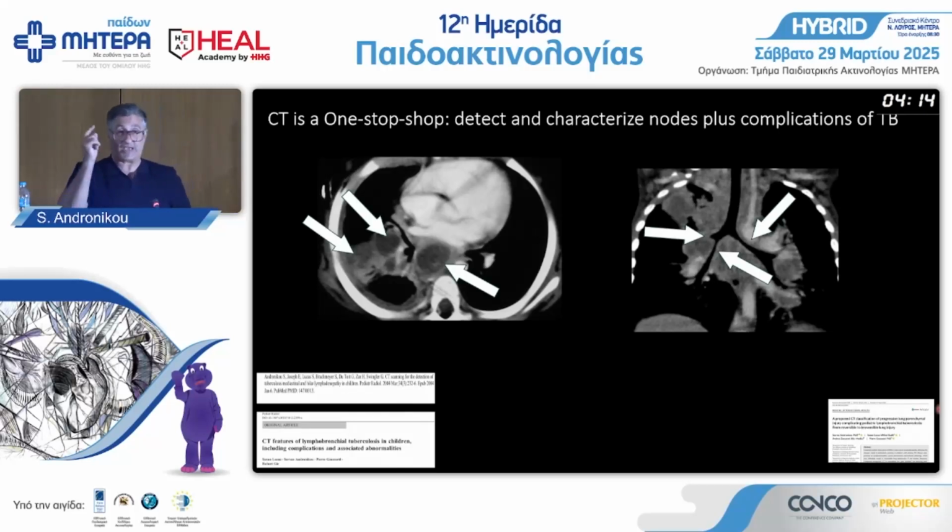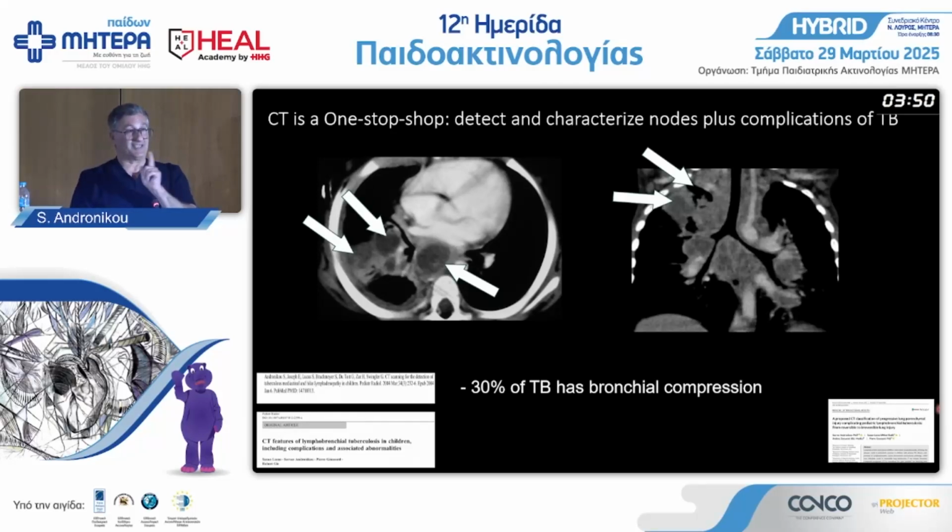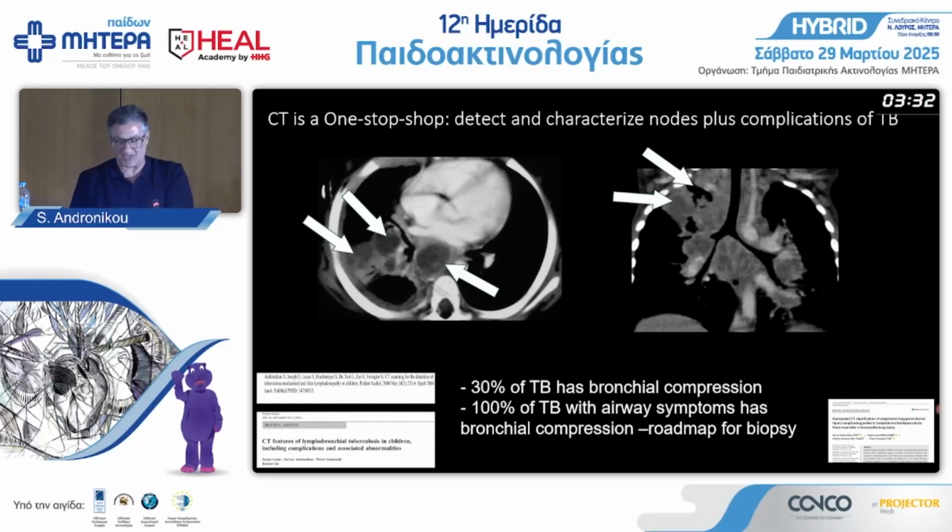That is destroyed lung. If you catch the bronchial narrowing at the bronchus intermedius stage, at the left main bronchus, the surgeons go in and enucleate, it's called. They take out a lymph node, suck out some lymph nodes, open the airway, or they do endobronchial cleaning and sucking, and you can prevent parenchymal permanent damage, okay? So, 30% of TB, when we did CT scans on 100 children in one study in 2003, 30% of children without respiratory symptoms have airway compression on CT, okay, from the lymph nodes. A different study, where every single patient with airway symptoms, stridor, wheezing, had visible airway compression on CT, okay?